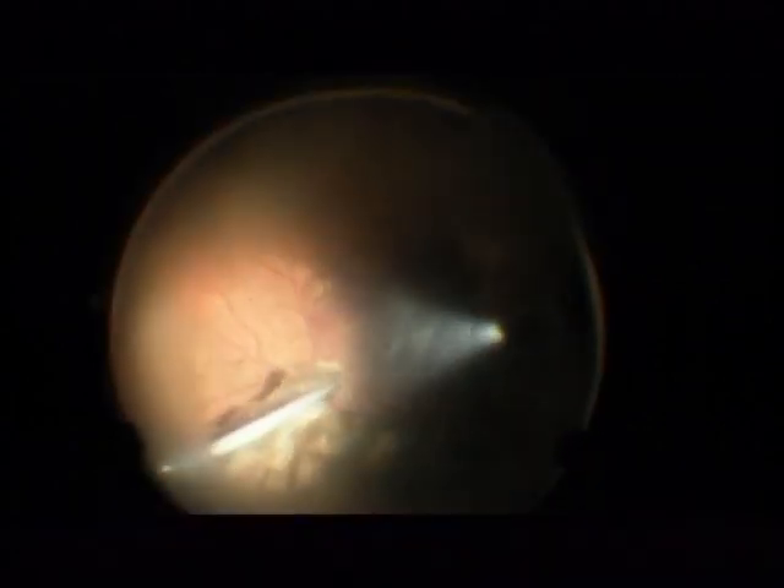I continue to remove this very dense hemorrhage inside the vitreous cavity, staining the complete vitreous. I assume that the hemorrhage is so severe in this case because there was strong bleeding from an arterial retinal macroaneurysm, resulting in very strong bleeding into the eye, staining the posterior capsule, staining the iris, and causing the severe IOP increase by occluding the trabecular meshwork with red blood cells.